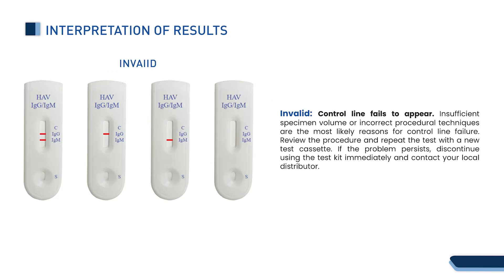Invalid: if the control line fails to appear, insufficient specimen volume or incorrect procedural techniques are the most likely reasons for control line failure. Review the procedure and repeat the test with a new test cassette. If the problem persists, discontinue using the test kit immediately and contact your local distributor.